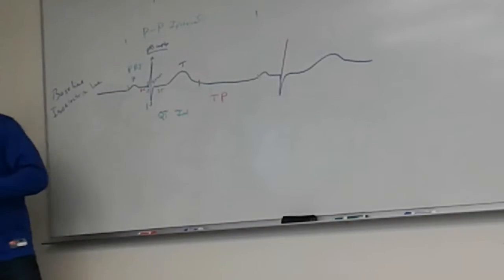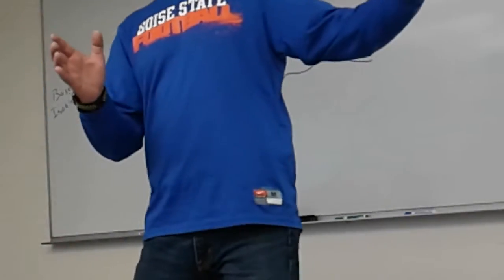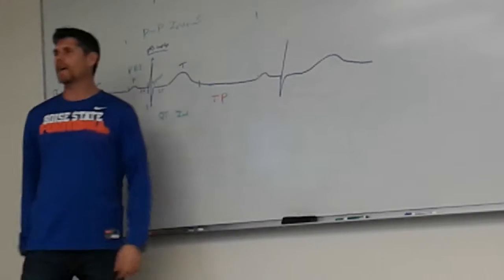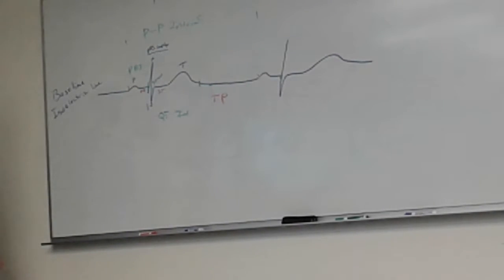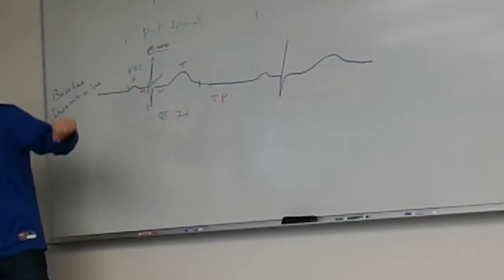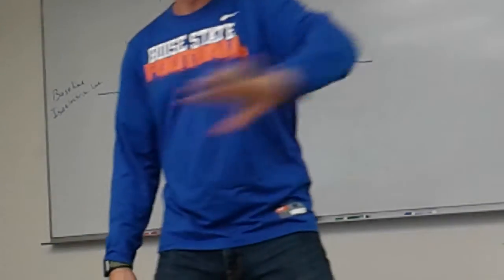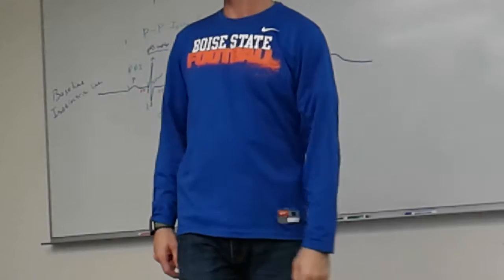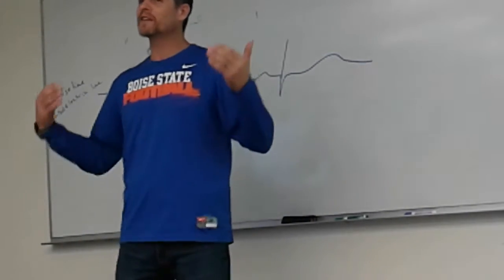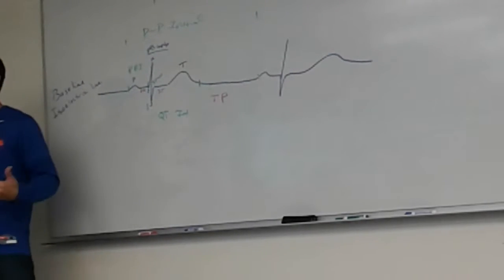In a person that is completely normal in their physiology and at rest, we can make some assumptions about what we're going to see in their cardiac cycles. For example, we will assume their SA node is working, and if it is, the pathway their electrical current takes from the SA node through the ventricles will be the same every single time. If the pathway is the same, then what will the P waves be compared to each other? Same. They have to be.